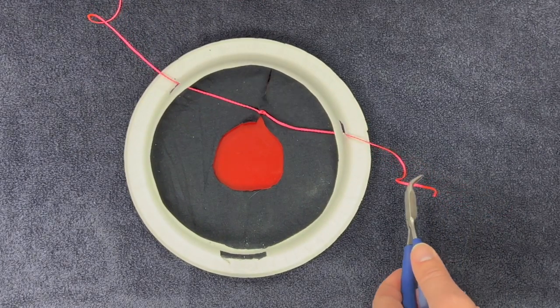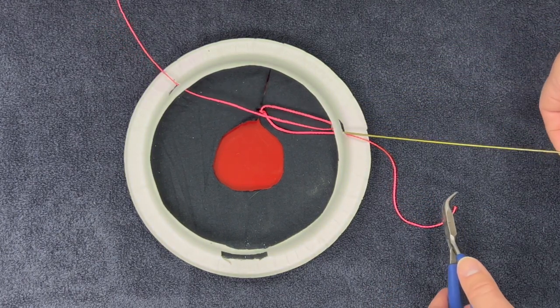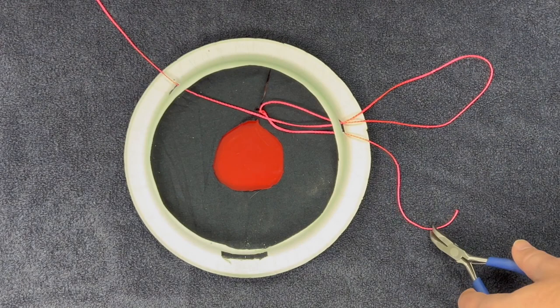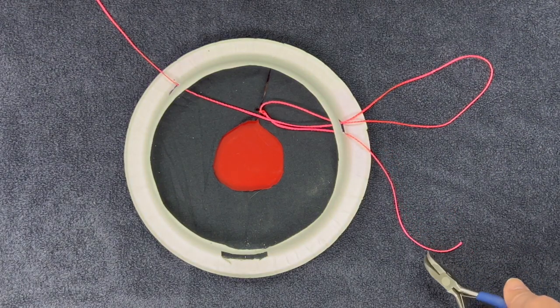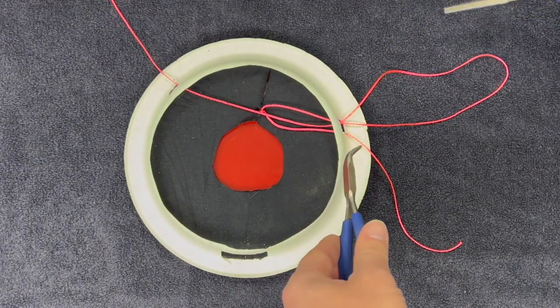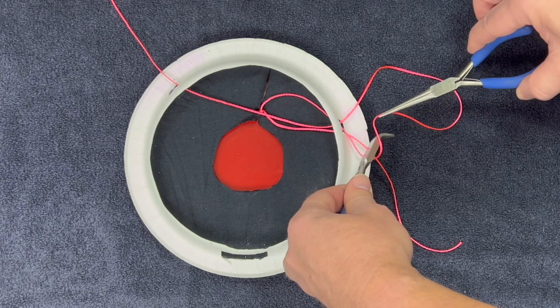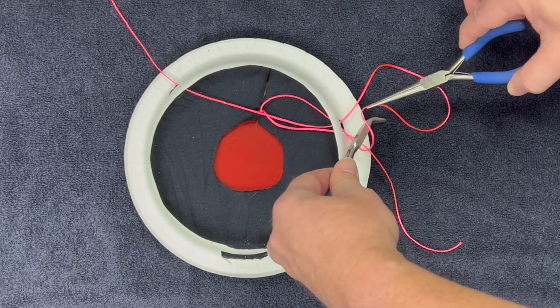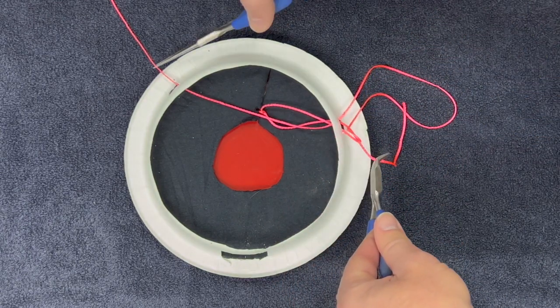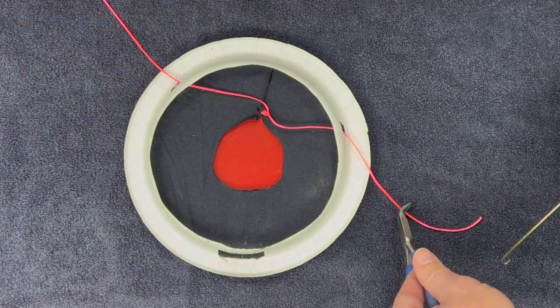Pull the loops, holding on to the free end, pull on the opposite side of the eye, and that's going to pull the knot into the eye. That's your first throw of a 2-1-1. We'll then come back with our bond hook, lens manipulator, or condon snare and reorient the suture the same exact way. The bottom strand is your original free end, the middle strand is the other end of the knot, and the upper strand goes all the way through the anterior segment. Take your curved tyer, point it towards you or out of the wound, and wrap the other direction. So now we have our 2-1 of a 2-1-1.